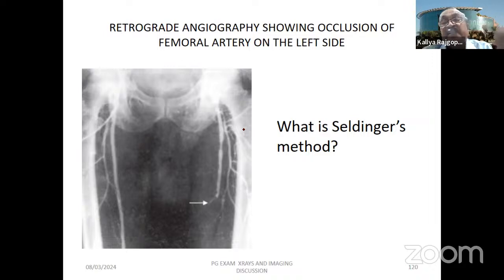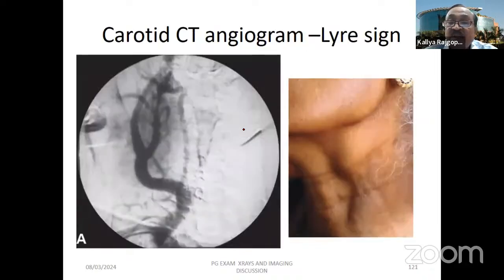So retrograde angiography is now rarely done. Rather, we should not do it, since CT angiogram is available everywhere. So that is the gold standard. Yes, just to show you one image here.